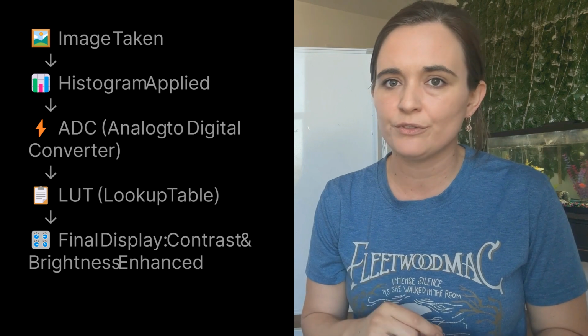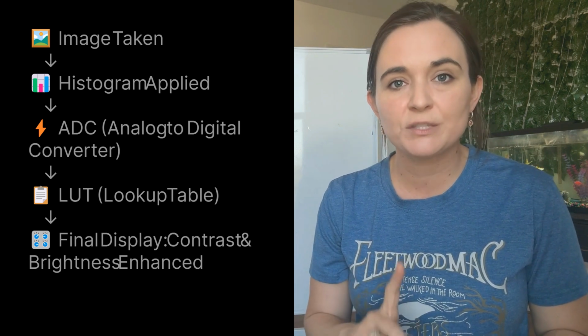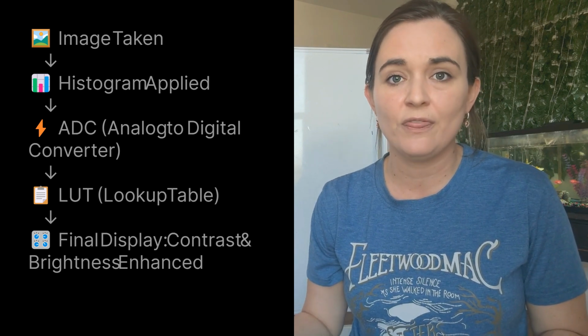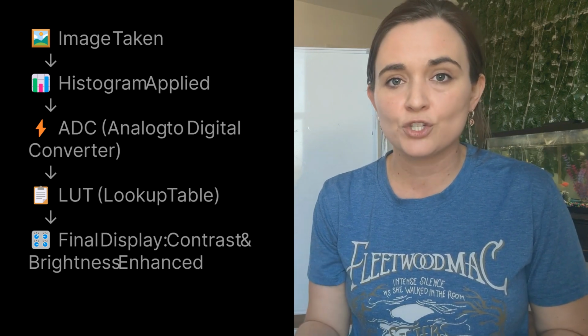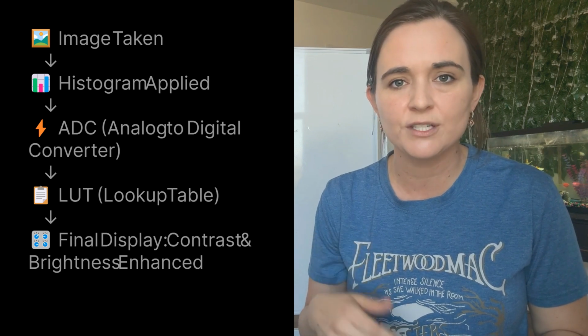But here's the truth. Bad input equals bad output. So check your exposure indicator, contrast, noise. Graininess means underexposure. That's quantum mottle. Check for motion blur from breathing or poor timing. Look at the sharpness. Can you see bowel walls, psoas lines, and organ edges?